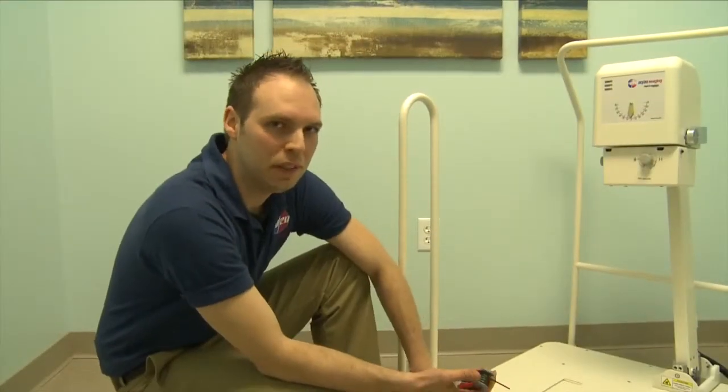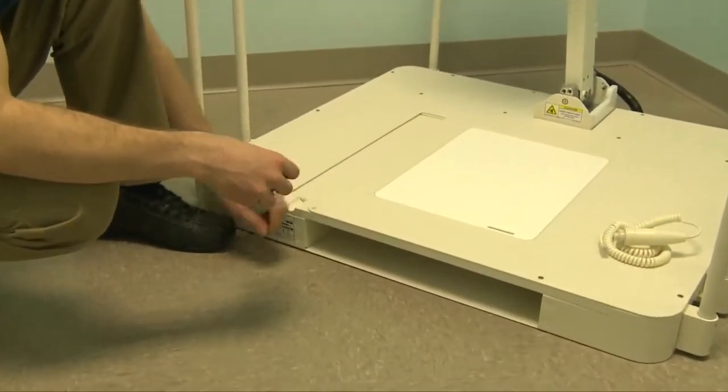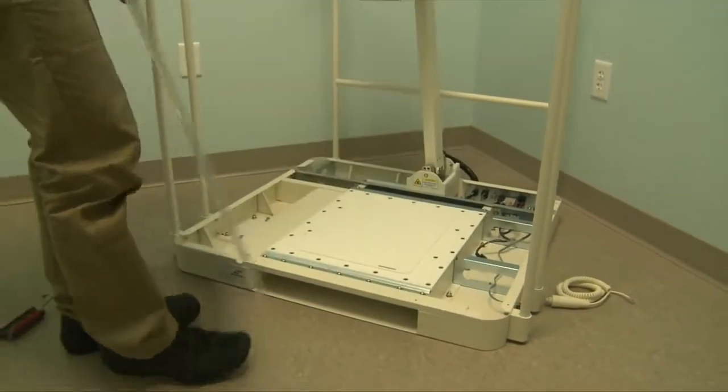The next step is to remove the screws off the top of the base so we can lift it off and run those cables through the base for the panel. Carefully set this aside.